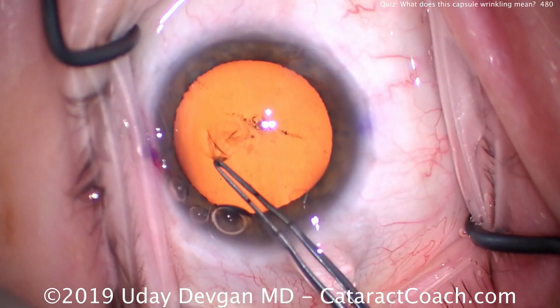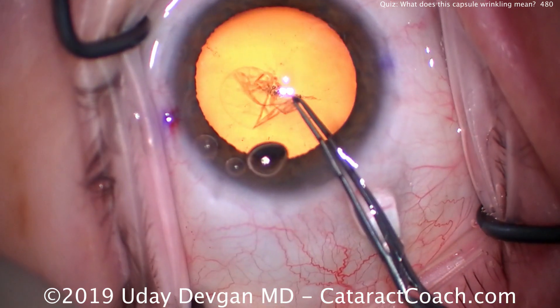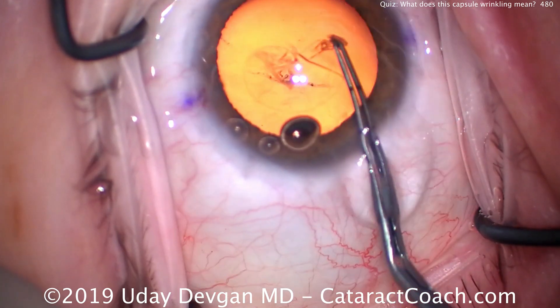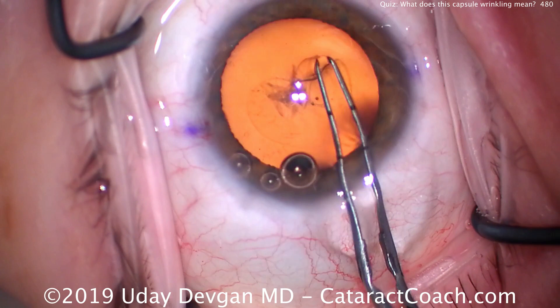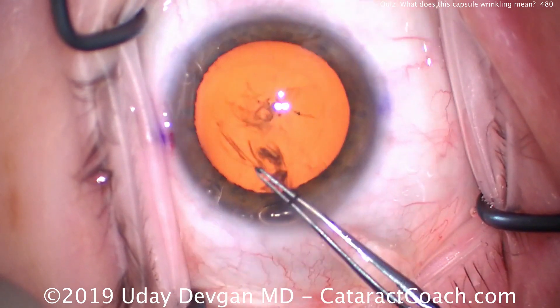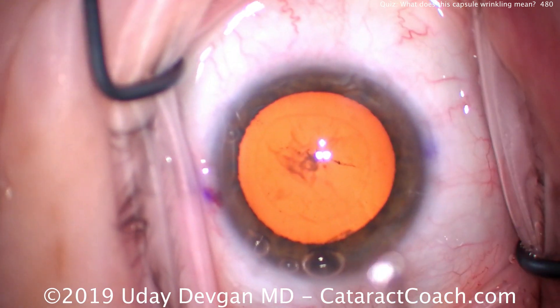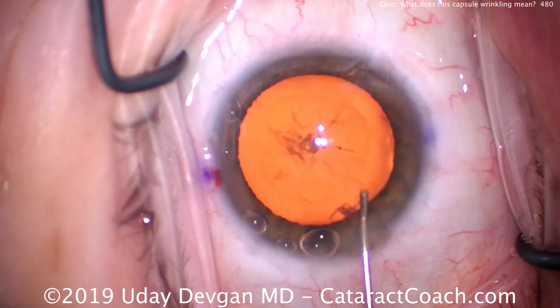Now we're finally able to poke in and start our rhexis. As we complete the capsule rhexis, we see that it looks okay — there's enough tension on the anterior lens capsule that it's being held so we can create the capsule rhexis. In extreme cases of zonular weakness, we may even have to use a second hand or instrument to hold the capsule while the other hand makes the rhexis.